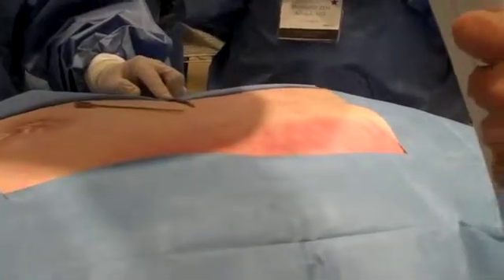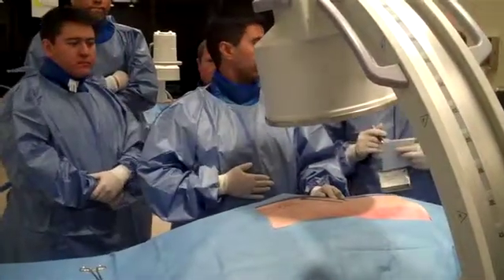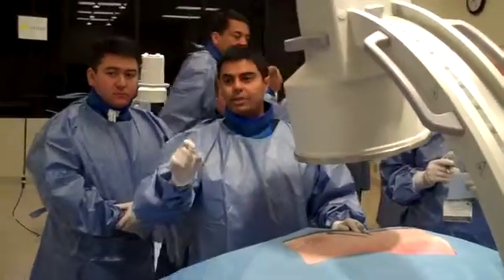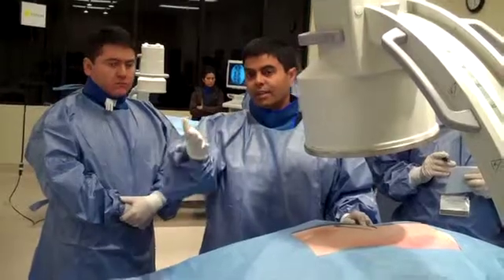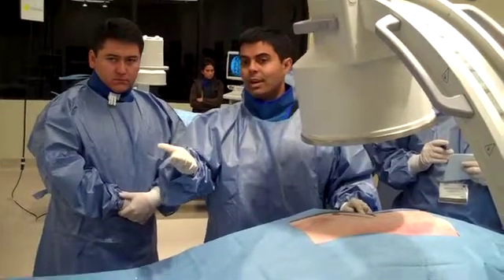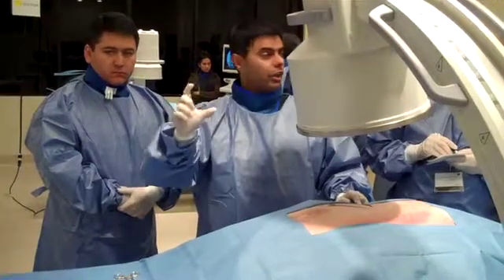Keep on tilting towards your feet. The reason that I'm tilting towards your feet is because it's a lot more important to me to actually have the spaces open up than it is to have the end plates leveled off. Luckily, we got lucky over here and the end plates are leveled off also. But really what we're looking for, and what's more important to us, is that we actually open up the end plates.